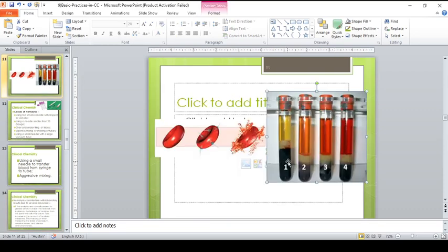So guys, if hemolysis happens, take note, some of the analytes that are present in the serum, their concentration is higher inside the red blood cell. So if the red blood cells are lysed, nasira yung red blood cell, anong mangyayari sa mga analytes na nasa loob ng red blood cell?